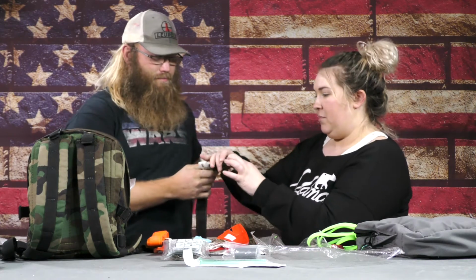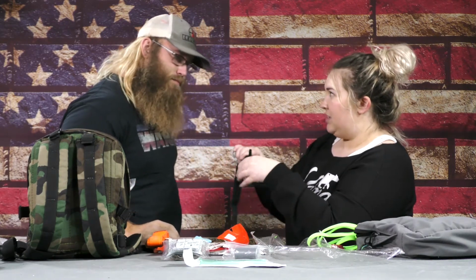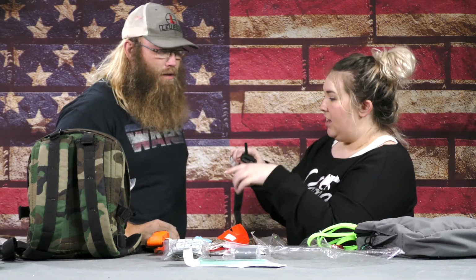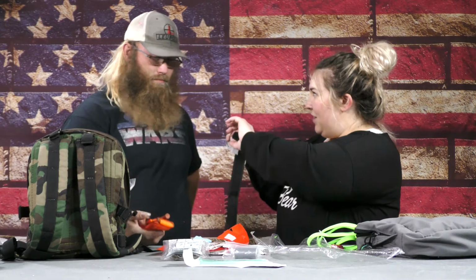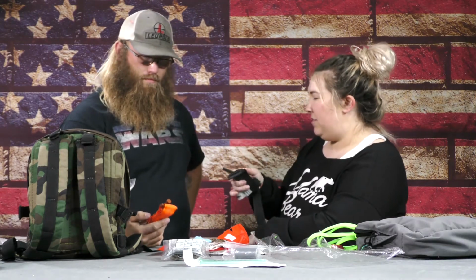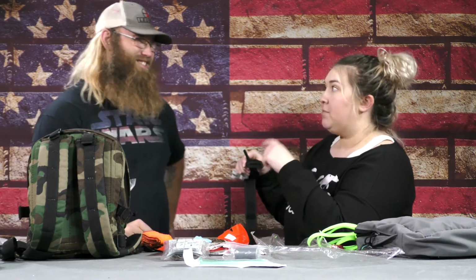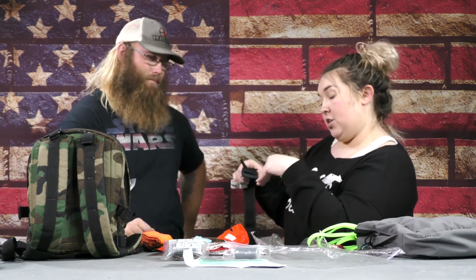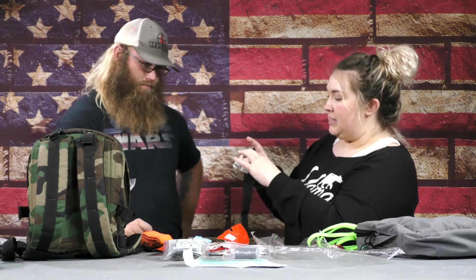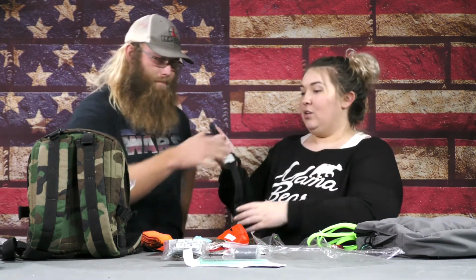What were you saying? That on some of them, like the Recon, the way that they sewed it was so that this wouldn't twist and loosen the tourniquet. Oh, okay. Because on some of those, it wasn't sewn like that, and if it twisted, it might have been the Softy. I'm not sure. You have to be really careful to make sure that you're buying the correct brand, because there's a lot of knockoffs that have the real name on them, but they're not the correct brand. Because if that slips, then it gives you that much more space, and that is enough to loosen the tourniquet.